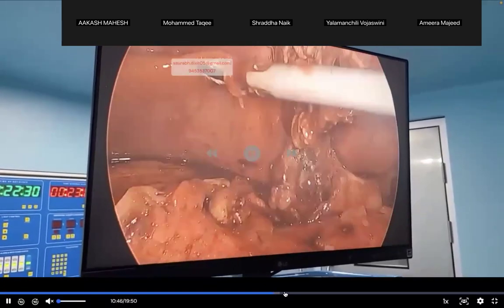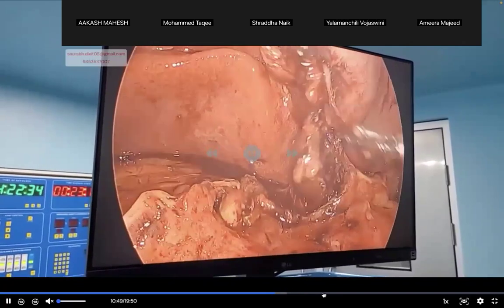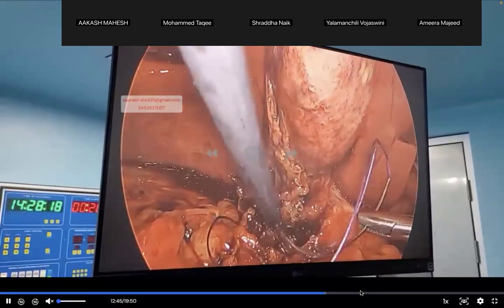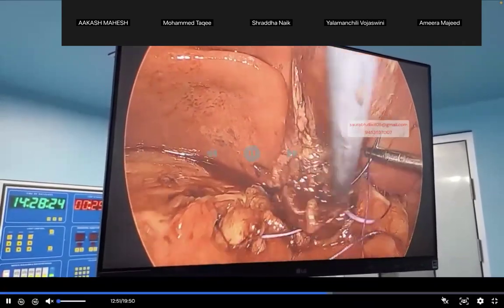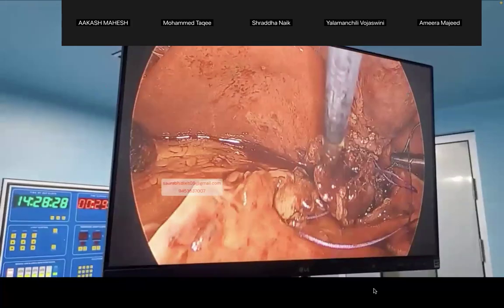There is no problem. I've opened up the gallbladder, evacuated the contents, and just see that ugly looking gallbladder will also be very neat and clean. Now I'll use an endo bag. Now in this case, I will suture the stump also, because I think that was too wide. So you can see I will take, this is a combination of intracorporeal as well as extracorporeal.